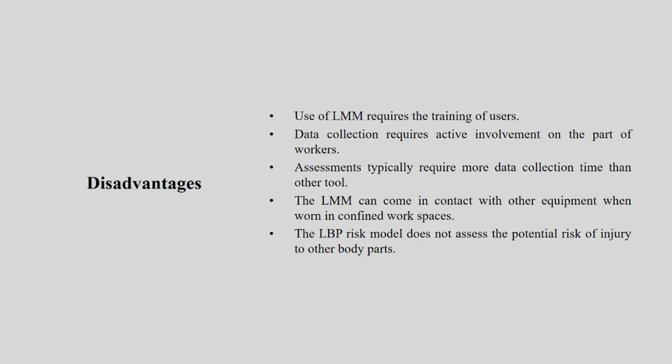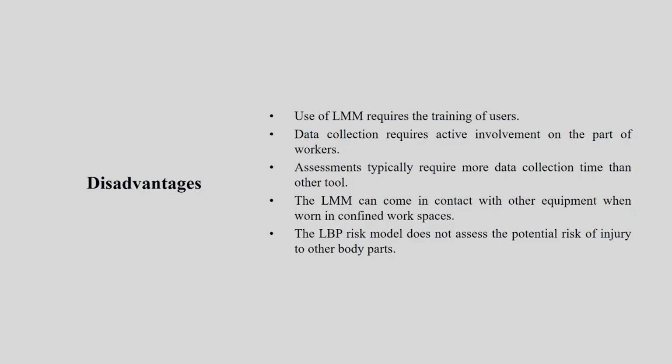Data collection requires active involvement on the part of the workers. If someone is not ready to accept that I will wear this exoskeleton and work, you will not get the data. So subjects' participation is very important. Assessment typically requires more data collection time than any other tool, because you have a lot of setup, then actual data and all those things.